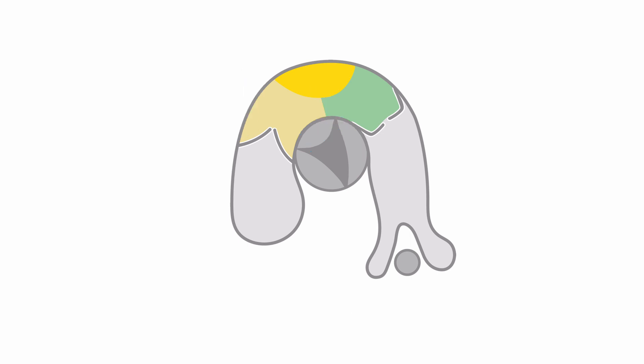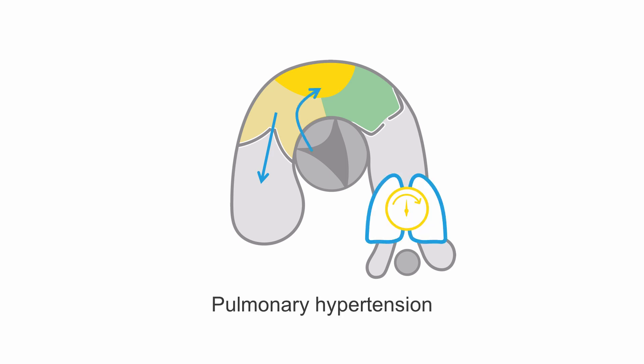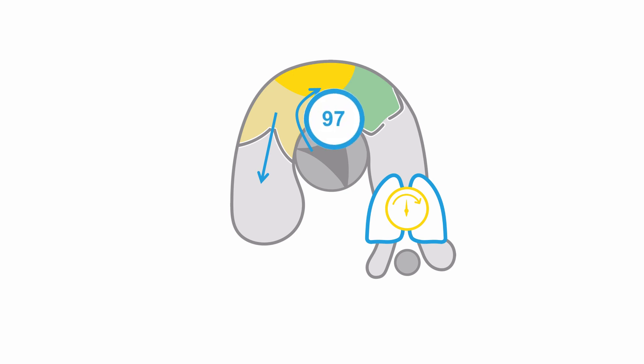So now we have a high tricuspid regurgitation velocity and a low velocity ventricular septal defect, which both suggest pulmonary hypertension. However, we know there is an intracavity gradient, so these parameters do not reflect pulmonary pressure in this case. You can see how important it is to evaluate the gradient properly.